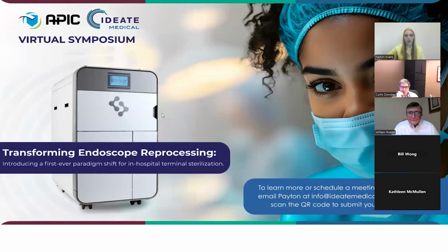Carmen had a great question. The drying station that was used, was this technology that had to do each lumen manually, or do you have connectors that allowed it to be more automated? Bill, we did each lumen manually, right? We did each lumen manually, yes. Yep. That would certainly be an opportunity to improve this process. Again, that was a very temporary thing that we put into place for this 30 scope trial. So there are some opportunities for improvement with how we did it.